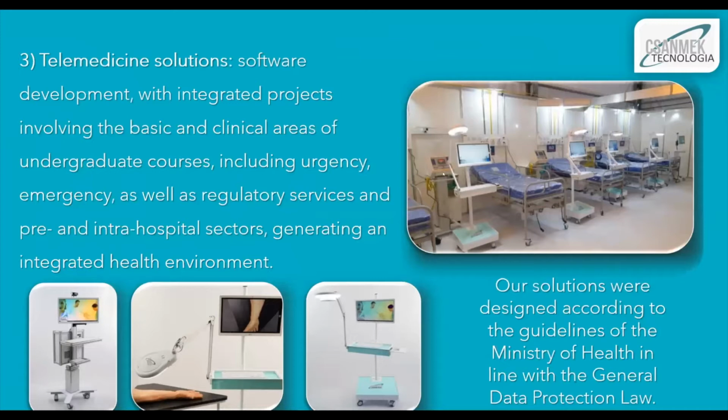Here you can see some of our telemedicine solutions. Telemedicine is a very hot topic at the moment with COVID and with everything that we have right now. So we can provide telemedicine consoles where the patient is going to be looking at the physician, communicating with the medical team, and the medical team can import all their protocols in a safe environment and control all the patient information and the protocols without needing to have physical access to the patient.